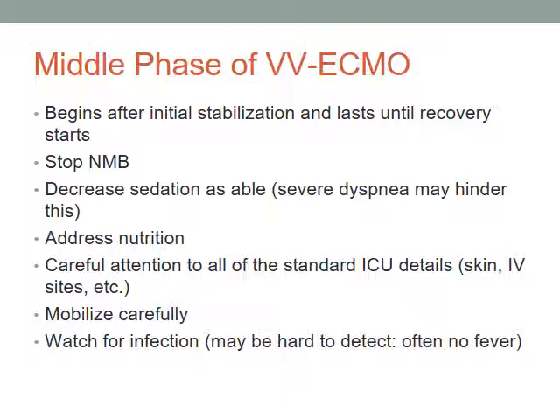Infection is a big potential issue. These patients often don't have fever because we're controlling temperature through the ECMO circuit. They're losing heat by having 4 or 5 liters of blood a minute removed from the body and run through the circuit. So it can be challenging sometimes to recognize fever.